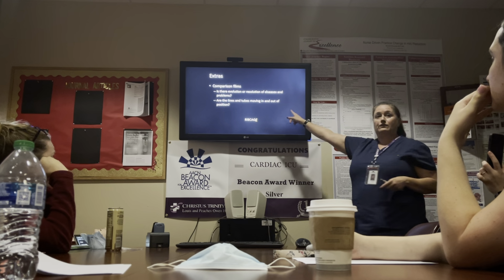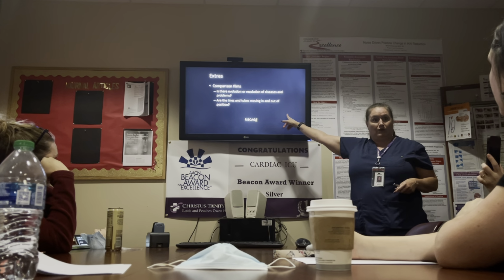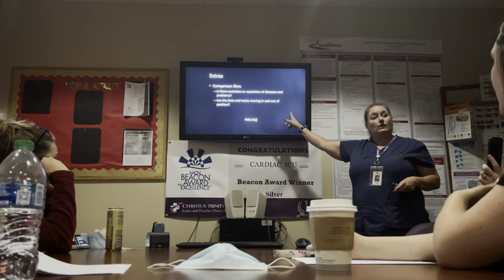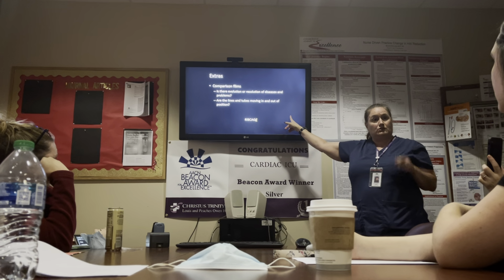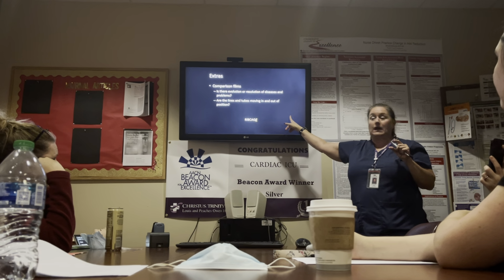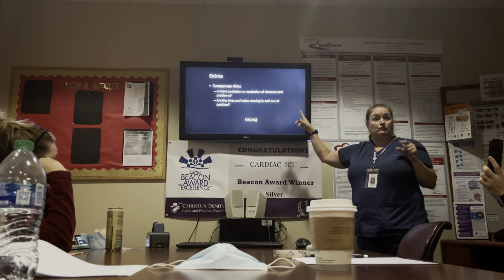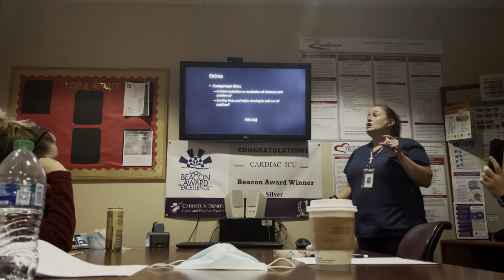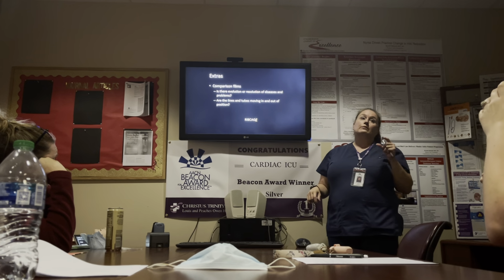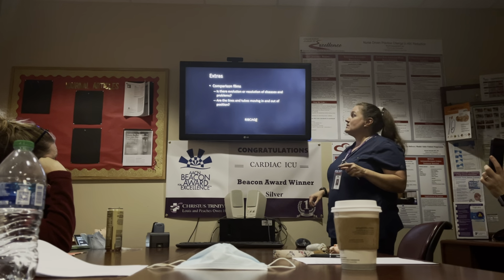And then the other thing too is I do a lot of moving and hauling patients. You guys do a lot of moving and hauling patients to various tests and whatnot. So when you get them moved, you need to make sure that their endotracheal tube is in the same place that it was when you left, okay? Or that their lines and tubes are in the same place that they were when you left. Your Swan is in the same place. Because invariably when we take them on a transport, we're going to end up misplacing something or dislodging something, and then that becomes a serious problem.